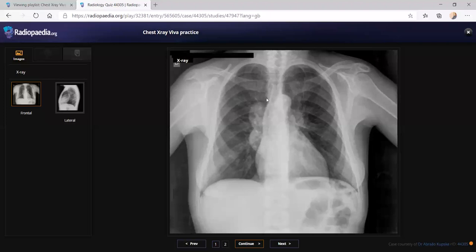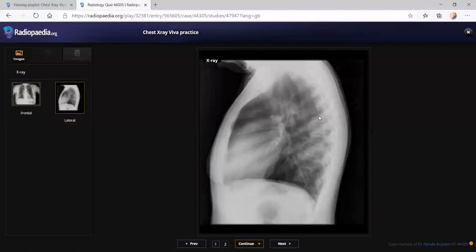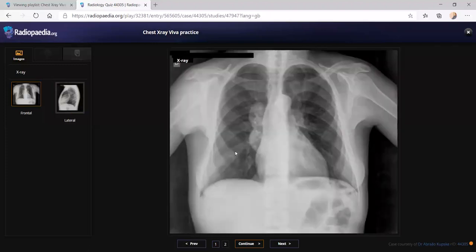You described the lesions very correctly. I'll confirm with the lateral view, and then you can see this is in the posterior mediastinum. If this patient is already in hematology care, fine; otherwise you will send them to hematology. But usually there will be hematology care and they'll be coming for a follow-up. So once you diagnose it, the film will come down.